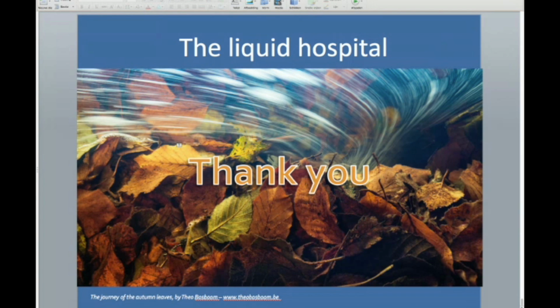So this eliminates redundant examinations also. Do you send all your images from your hospital and from other hospitals in the northern part of Belgium to this web PACS? Yes, this is not the only one. There are several players in the market, but this is one of the biggest. And yes, all the hospitals that are customers do send the images and even the reports in some cases.